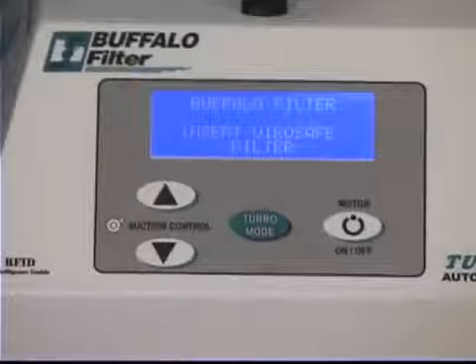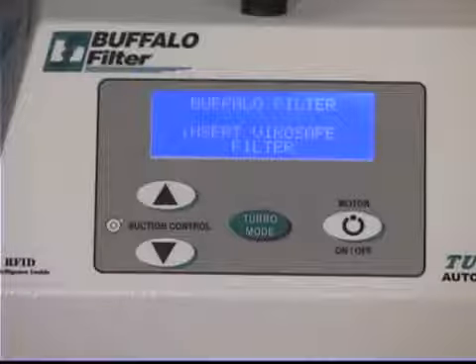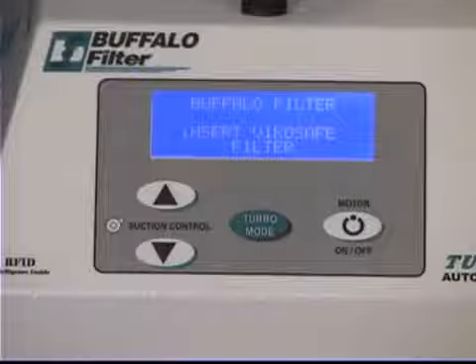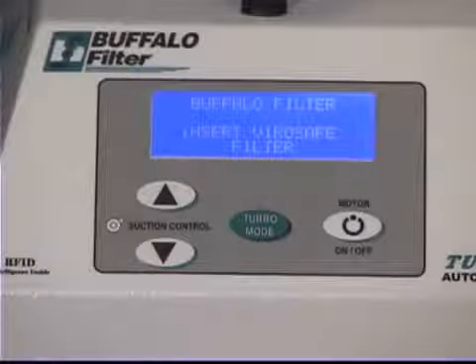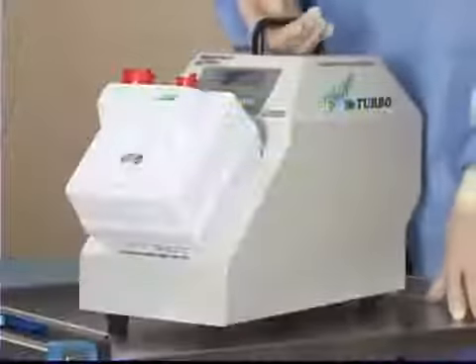If a non-ViroSafe filter is placed into the unit, the system will not operate as the system is designed to work exclusively in conjunction with a ViroSafe model. This feature ensures proper capture of the harmful elements within the surgical smoke, as well as proper operation of the system over time. If the unit is not on, you may now turn the system on.